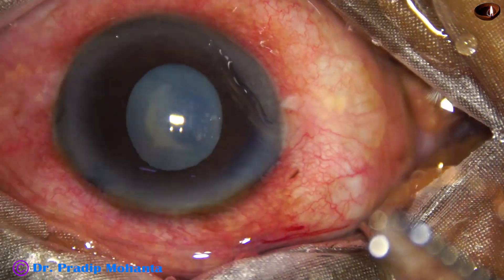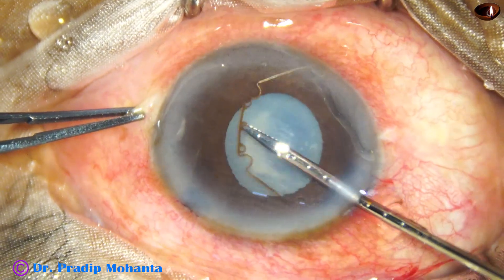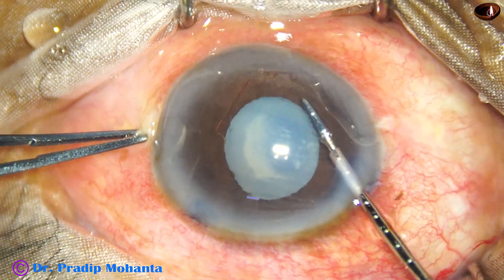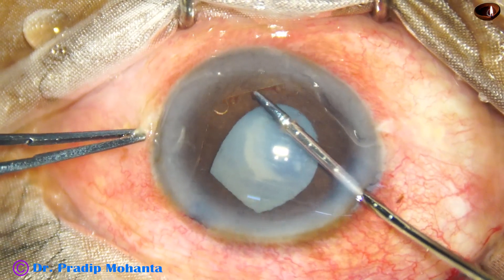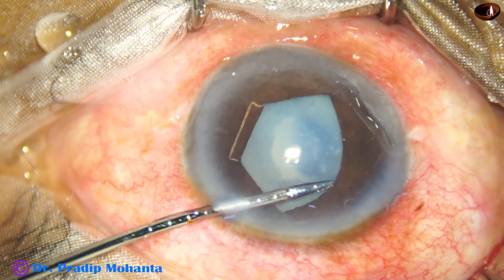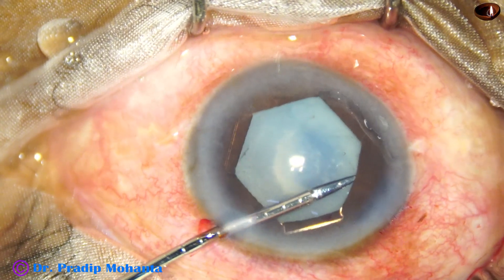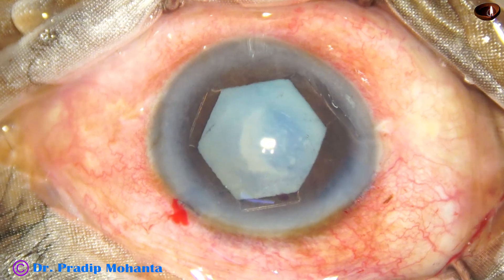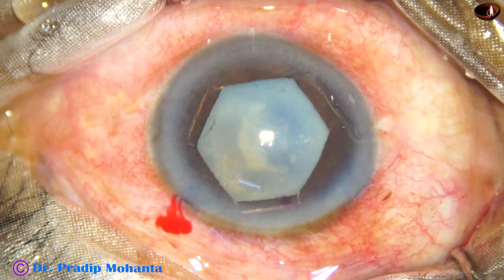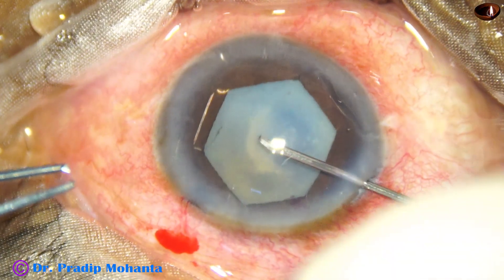I hold the middle tab with the B-hex forceps — this is a 23G B-hex forceps. Go inside, turn a bit and place this flange under the side port, centered at 11 o'clock. Then the middle tab is placed towards 5 o'clock, and then go through the left side port and place this flange towards 10 o'clock. The pupil has now taken a beautiful hexagonal shape, and this dilatation will be maintained throughout the surgery.